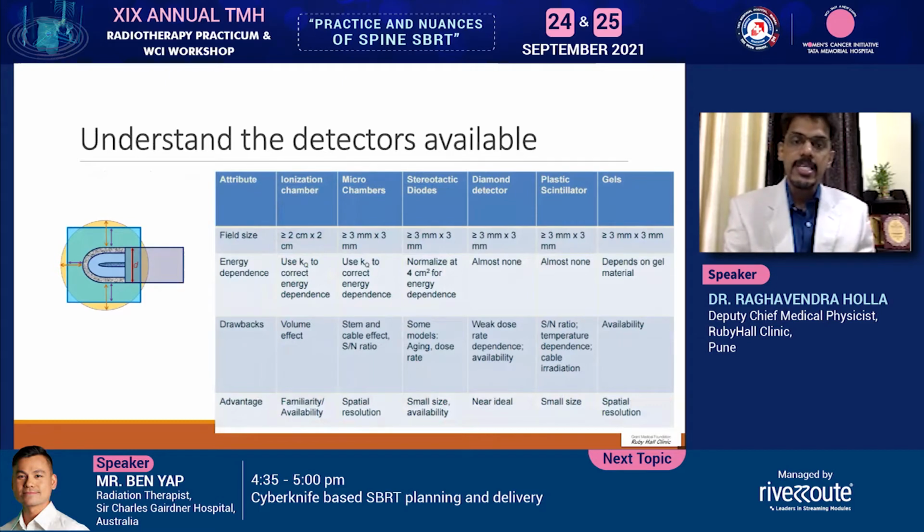The site physicist, I'm not getting into the detail of this again, as I said, needs to be very, very careful about the dose measurements and the selection of the proper chamber, because you're talking about MLC fields of less than 2 centimeter field size. So the output factors are the ones which are mostly influenced by the chamber size. So make sure that you have the proper one.